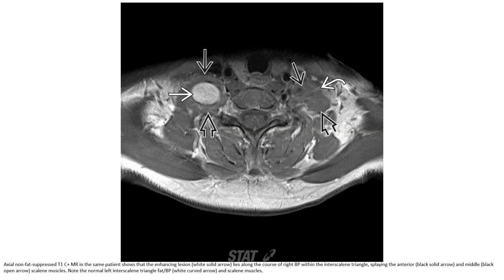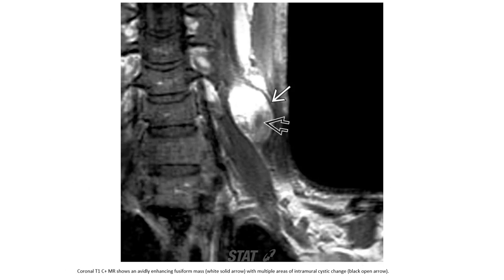The C7 nerve root in the paravertebral space is demonstrated. On T1 with contrast, there is a vividly enhancing fusiform mass with multiple areas of intra-tumoral cystic change.